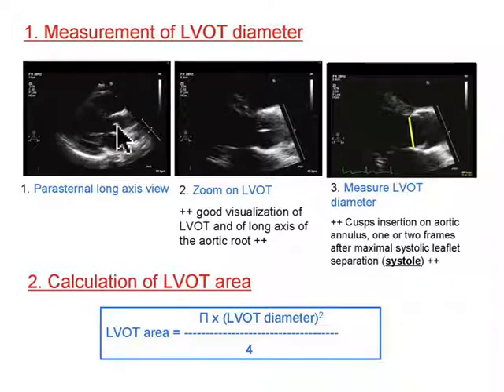And actually right now I can tell that when this aortic valve closes, the leaflets come together and have that little white line at the tip of my arrow. You can see that little white line. That's the leaflets that came together. So that's during diastole, the heart's filling, those leaflets are together. Now, this is just a frozen and zoomed-in version of that exact same valve.